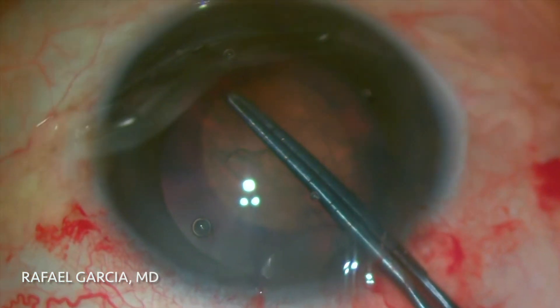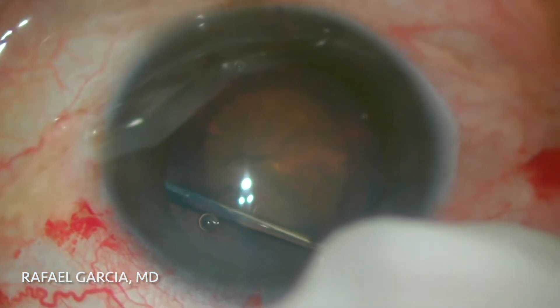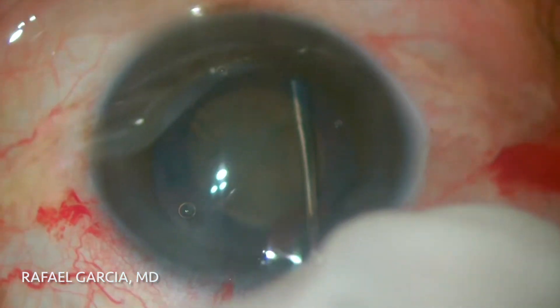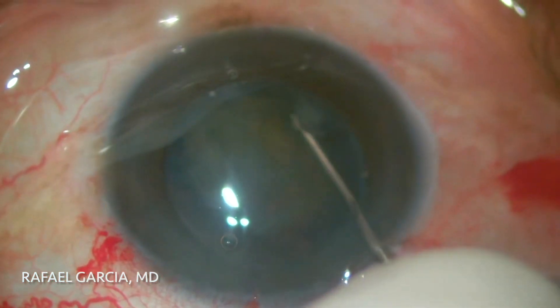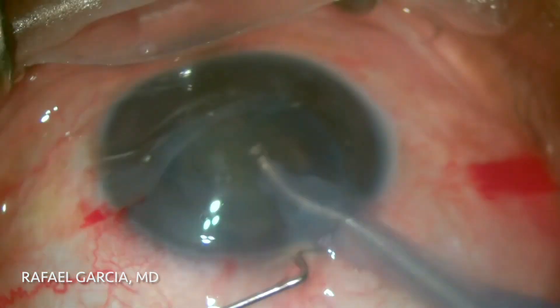There it is — just about a perfect diameter. Some hydrodissection is done to free up the nucleus, and then it is rotated with the chopper. The nucleus does spin, and the central corneal endothelium is recoated with some dispersive viscoelastic.